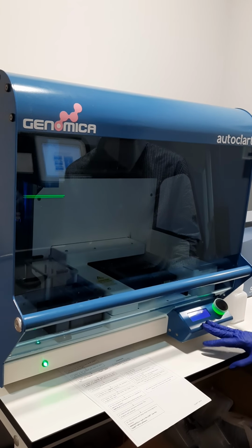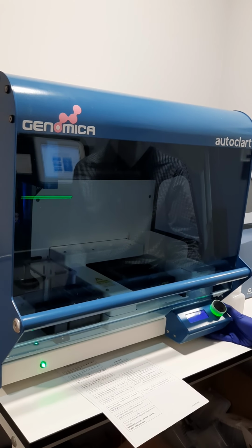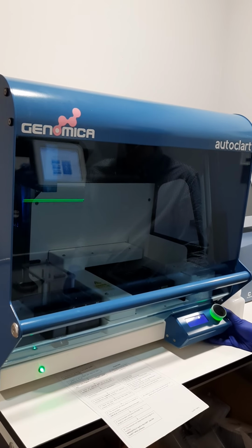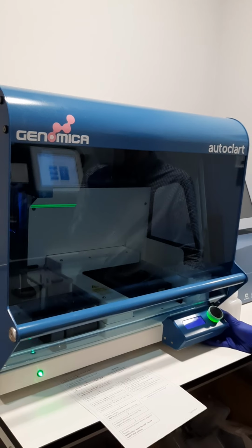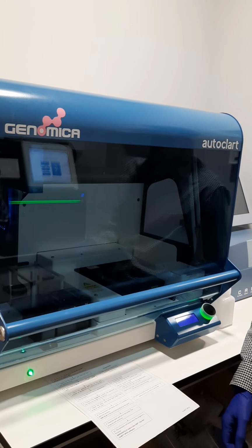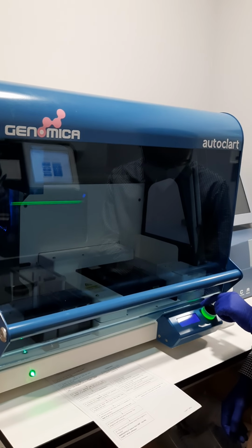Okay, now we select 8. Do we just have blanks as well? We have 4 samples, so we select 8. To add, I think, blanks. No, but for example, if we have 4, we can select 4. Okay.